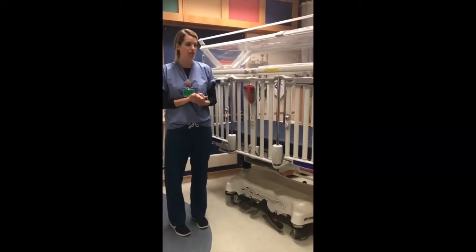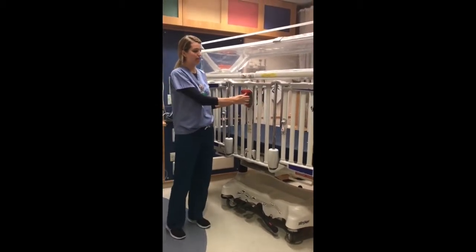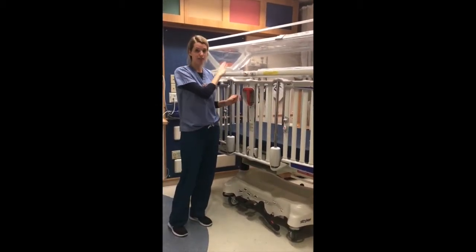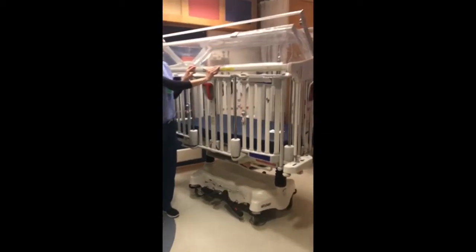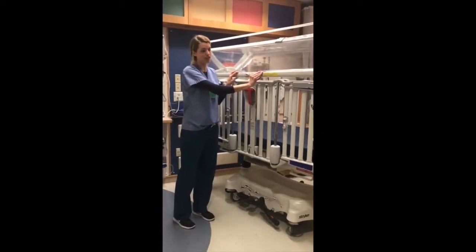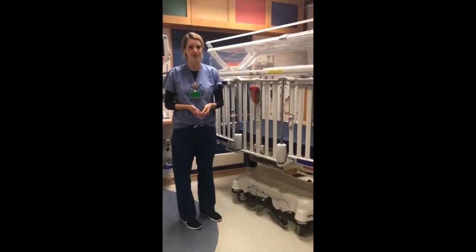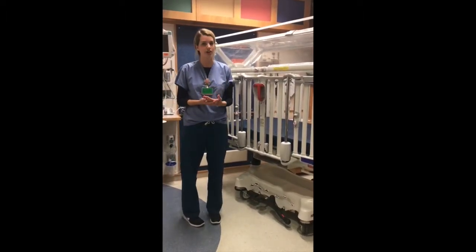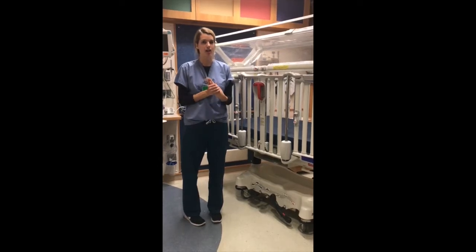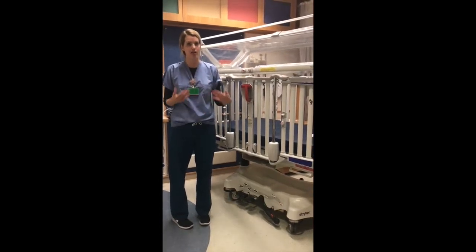When your child is left unattended, ensure that all four side rails — left, right, head of the bed, and foot of the bed — are in the locked position, and that the 'can't get out' feature is also securely fastened down. We recognize that these cribs are not always the same as the ones you have at home, so if you have any questions, please don't hesitate to ask your nurse or another healthcare provider. We are happy to help and give you an in-person tutorial. Our number one priority is the safety of your child.